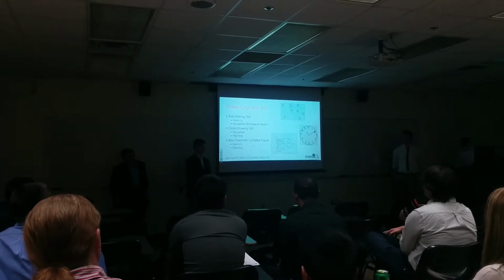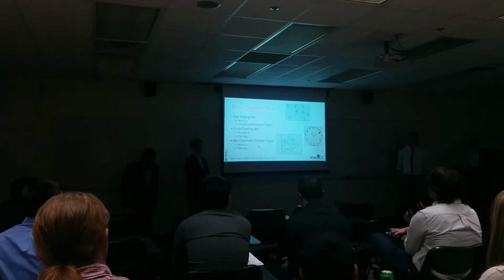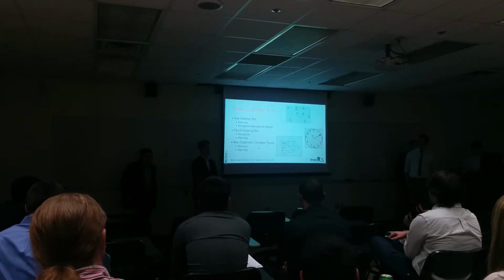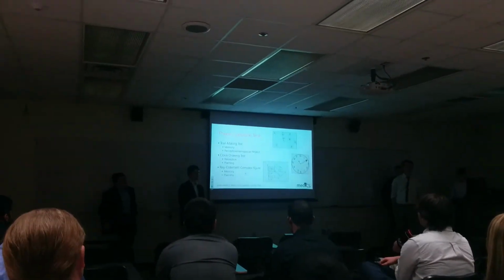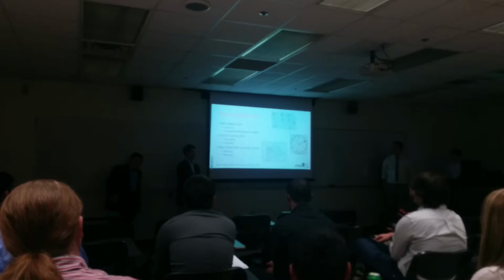One important characteristic is that it can help show the presence of a hemispatial neglect, which is an inability to process stimuli on a certain side of the body. So patients who suffer a stroke may not be able to see nodes that are on the left, and so if they consistently take time finding nodes on the left, they may have a left hemispatial neglect.